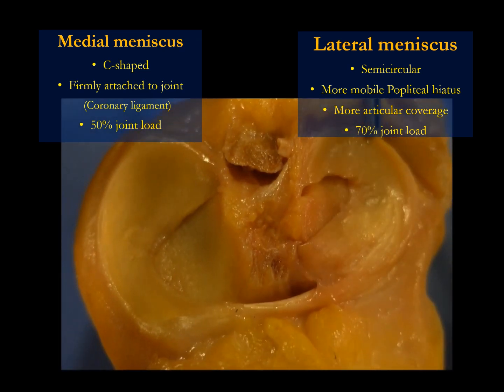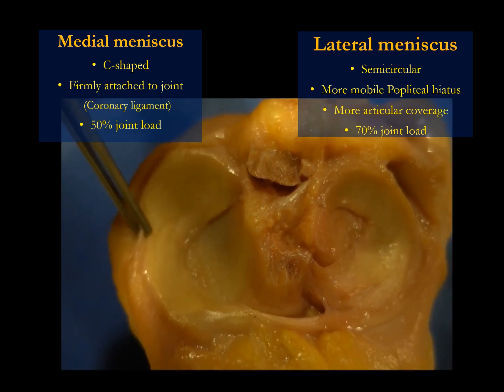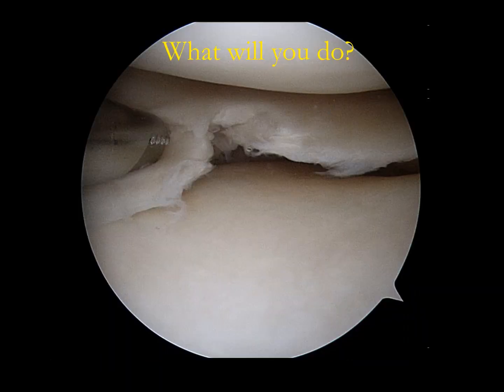The meniscus is very unique on the lateral side. The medial side is not the same. You need to know the anatomy of the meniscus also. I will not touch on it too much, but keep in mind the medial side is quite less mobile compared to the lateral side. On the lateral side, there is the popliteus in this area, and also this area is a free zone. There's no capsular attachment. This area is quite scary because behind the popliteus, from our study, the vessel is there. That's why God made the popliteus, to protect you. On the medial side, we have no problem with vascular structures. On the lateral side, keep in mind, if you are coming from this portal and you repair the meniscus in this area, behind this is the popliteus.